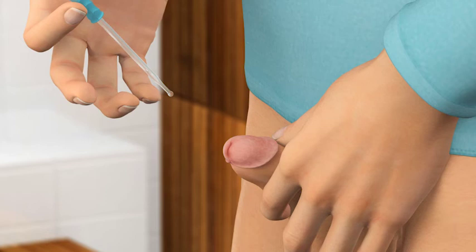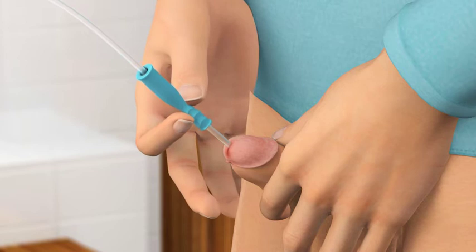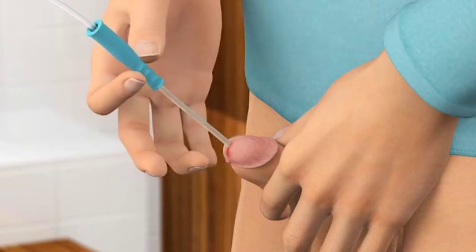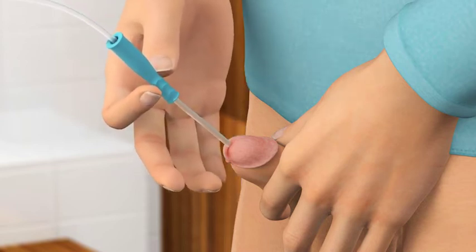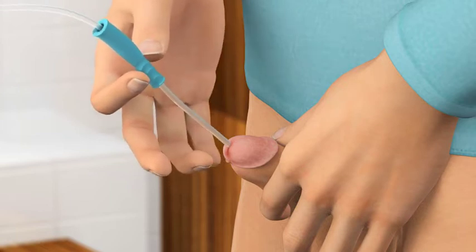Using a catheter is relatively simple, but will require some practice. In this film, you will learn how to empty your bladder using a catheter with an insertion grip. The insertion grip is used to push the catheter into the urethra bit by bit without touching the catheter, a bit like when using an oven glove to push an oven tray into the oven.